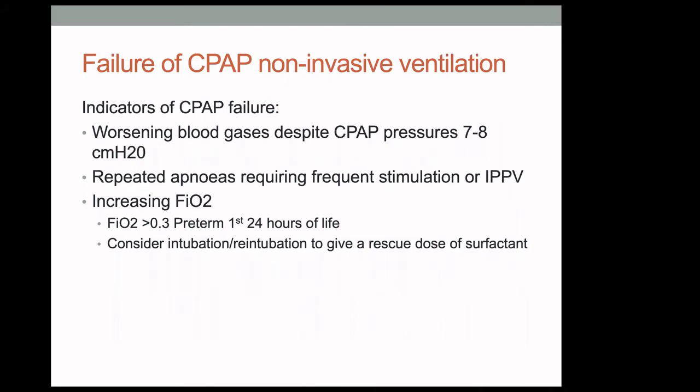And if babies are having recurrent apneas, so if they're stopping breathing, then CPAP isn't going to do enough to continue their breathing, so then you would need to think about escalating respiratory support onto mechanical ventilation.